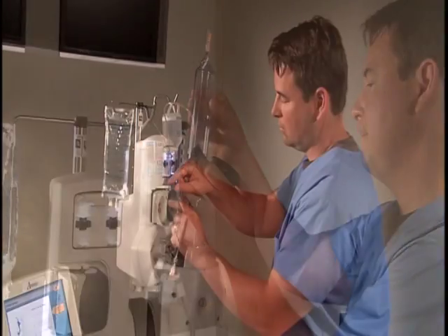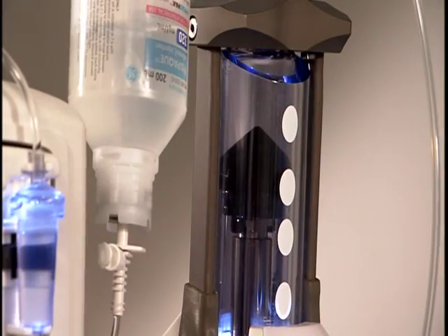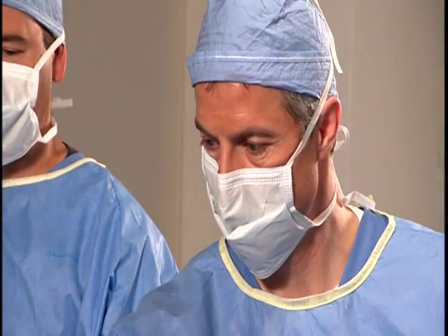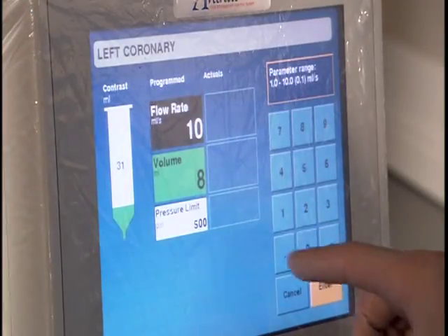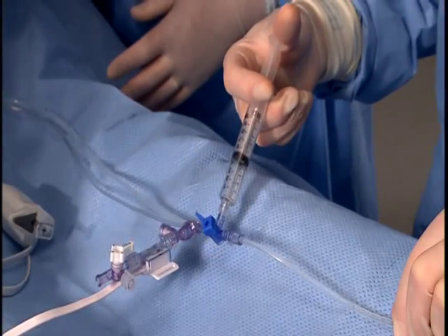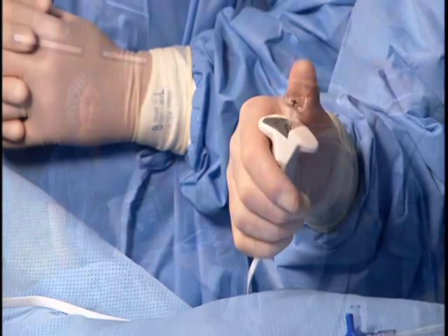This presentation demonstrates proper setup, programming, injecting, and refilling of the Avanta fluid management injection system. It is intended as a supplement to the operations manual. For specific questions, please contact your Medrad interventional representative.